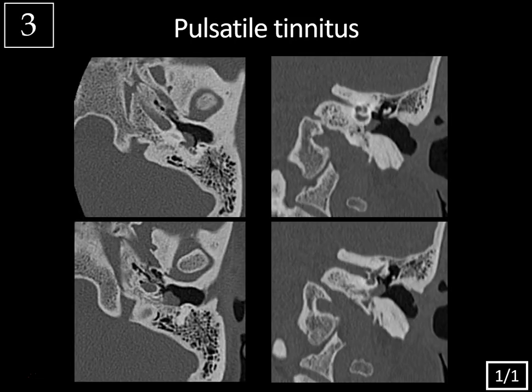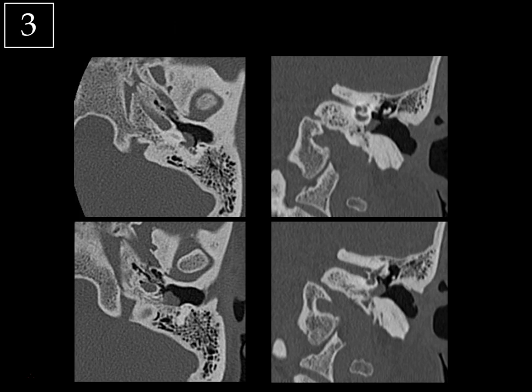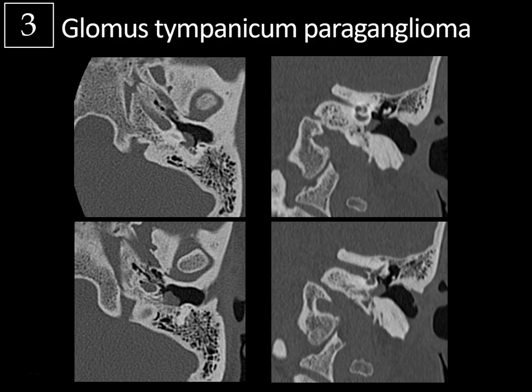All right, next case — temporal bone CT scan, history of pulsatile tinnitus. On the left we're looking at axial images, and on the right coronal images of the temporal bone. You can see there is this ovoid, somewhat lobulated soft tissue mass which is protruding into the middle ear. Its location is key — this is actually the cochlear promontory, which is the bone overlying the basal turn of the cochlea. On the coronal images, it's slightly extending into the inferior aspect of the middle ear but is not causing any osseous destruction at the floor of the middle ear. With the history of pulsatile tinnitus, this is typical for a glomus tympanicum paraganglioma — the most common middle ear tumor, classically appearing as a small mass on the cochlear promontory.